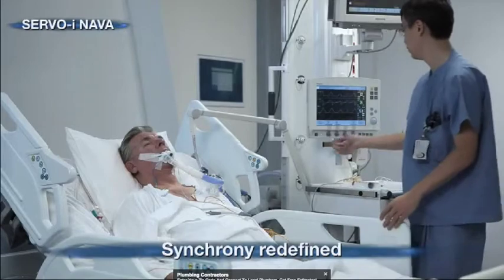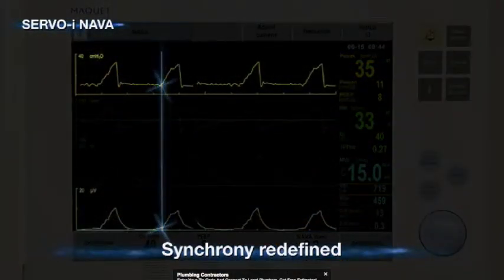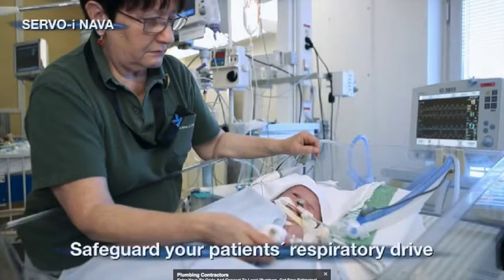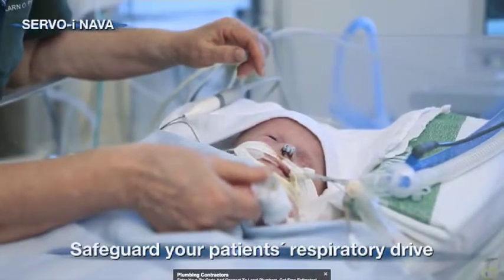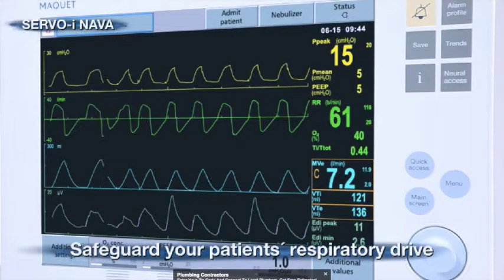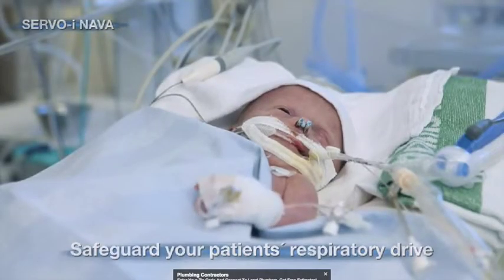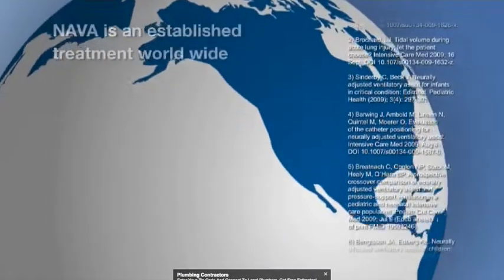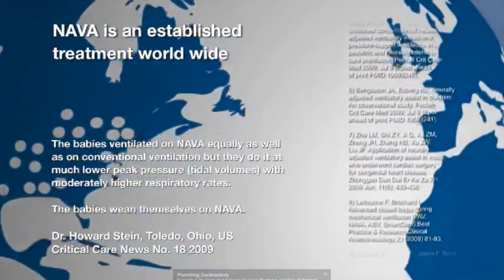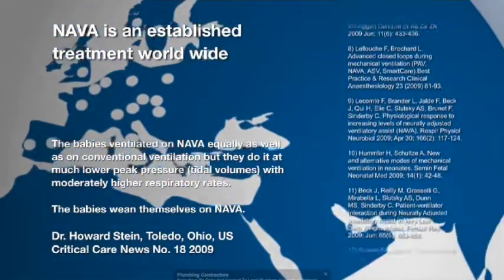NAVA can give the best synchrony between the ventilator and the patient. And it's a safeguard for your patient's respiratory drive. It can also be used for babies in the NICU, and for adults, invasively or non-invasively. So babies can wean themselves on NAVA. It's also used in adults.